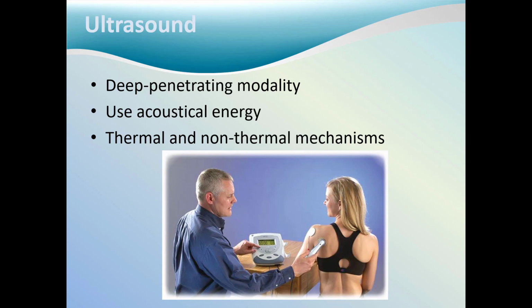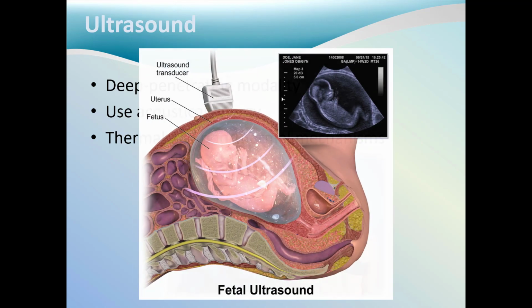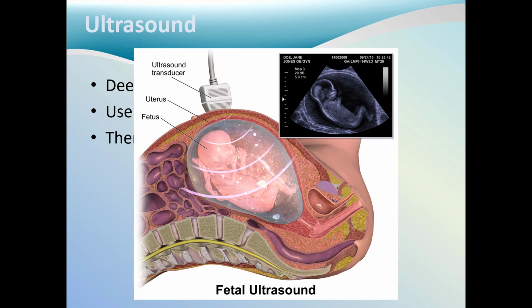Therapeutic ultrasound is an inaudible acoustic vibration of high frequency that produces thermal and/or non-thermal physiological effects. Unlike other therapeutic agents, ultrasound is not part of the electromagnetic spectrum, but uses acoustical energy. Depending upon the frequency and the wavelength of the energy, ultrasound can be used for diagnostic purposes, therapeutic deep tissue heating, or tissue destruction. An example of a diagnostic ultrasound would be a fetal ultrasound or a sonogram.